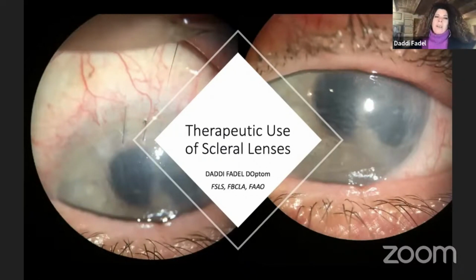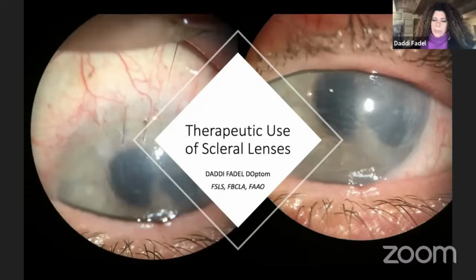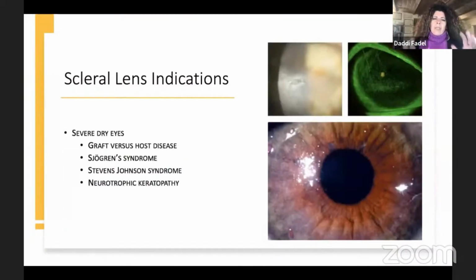Hello to everyone. Thanks to the organizer for the kind invite. It's a pleasure to lecture in this meeting. I will be talking about therapeutic use of scleral lenses, as agreed with the organizers. There are several indications for scleral lenses. A major group that can benefit from scleral lenses are ocular surface diseases.